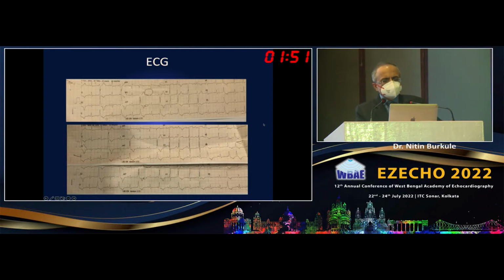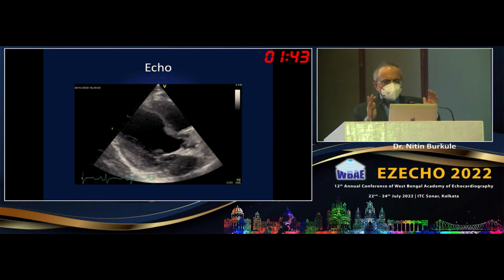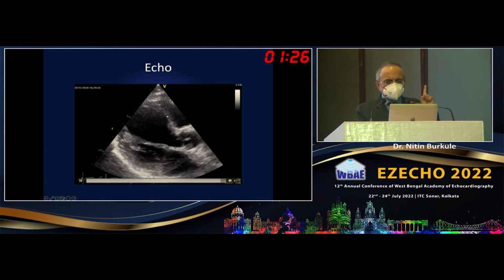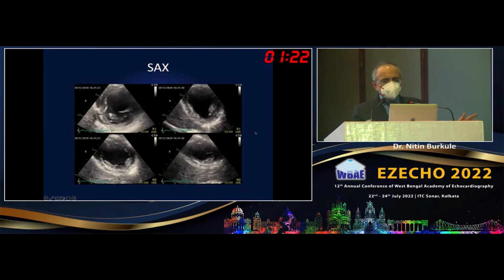And this is her ECG, and you can see that she has got multiple VPBs, sometimes bigeminy. And then you look at her echo. Now the moment the echocardiographer looks at this, he sees that there is a basal septal akinesia. Okay. And we know that if you have got a basal septal predilection, thinning and akinesia, we always think of sarcoid, correct? So we have an LV dilatation, we have a basal septum which is scooped out, and then there is akinesia. But there can be a twist in the tail.